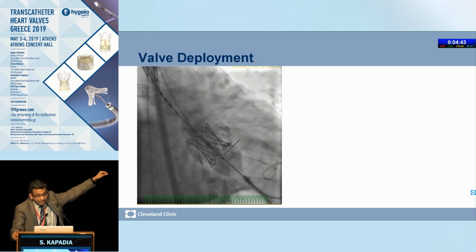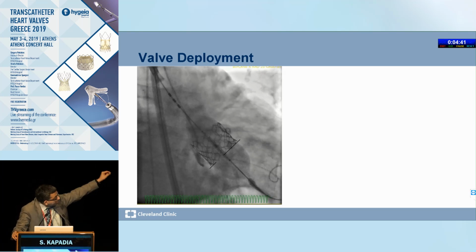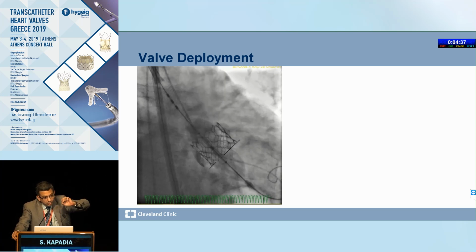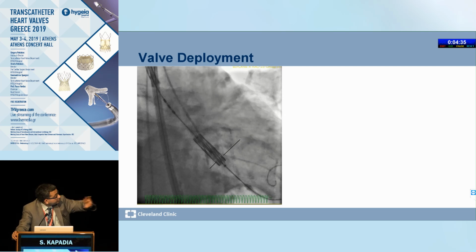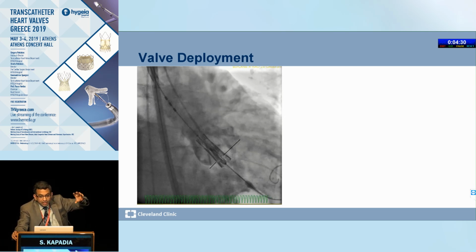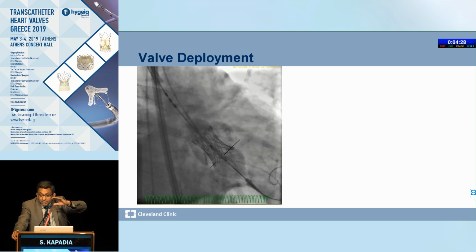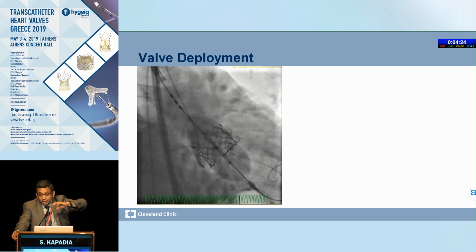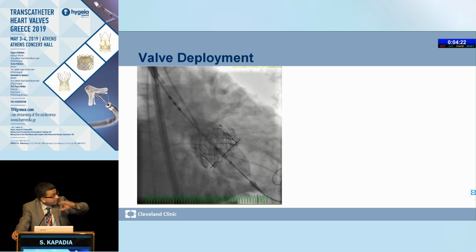The straight flush catheter is in the non-coronary sinus all the way down. It's a straight flush, so you don't have to remove the catheter because it is straight. It's not a pigtail. What I've done is square the valve, so the bottom of the valve is set like a CoreValve, where you make the ring the same way.